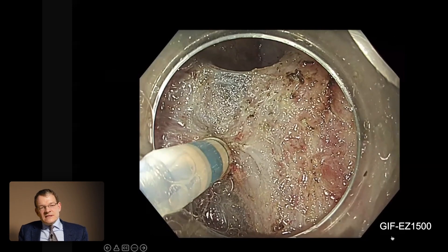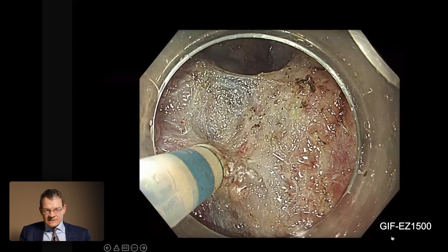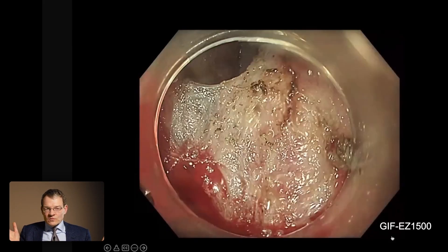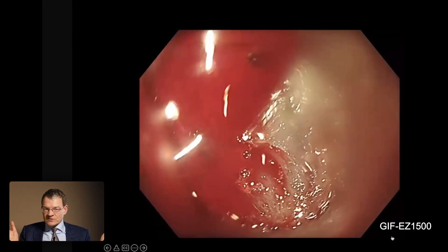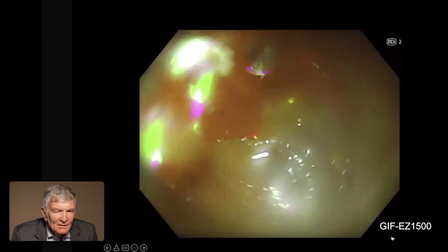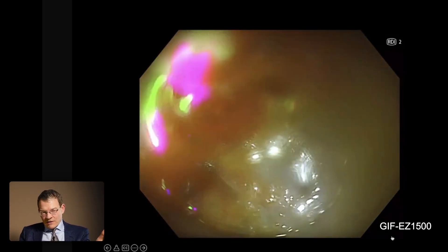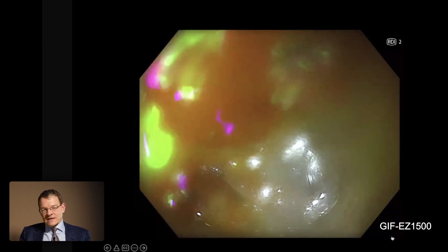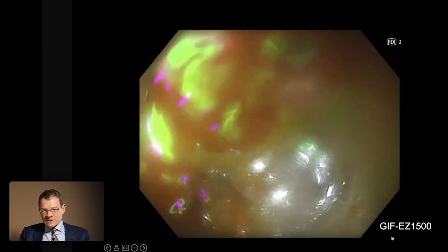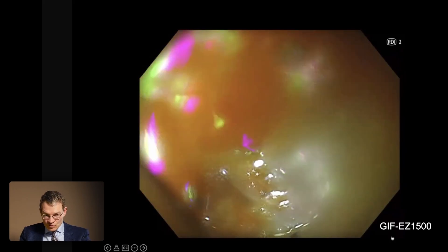This is an ESD where incidentally a vessel is cut — a typical situation where you lose the overview. Everything turns red; you can see there is something ongoing in the middle. But now using RDI you have less blood and you can definitely better see the source of the bleeding. So in such a situation this is very helpful for sure.